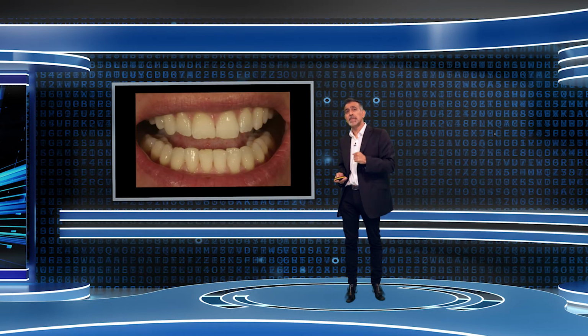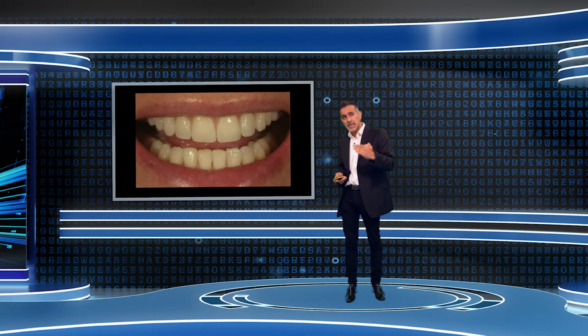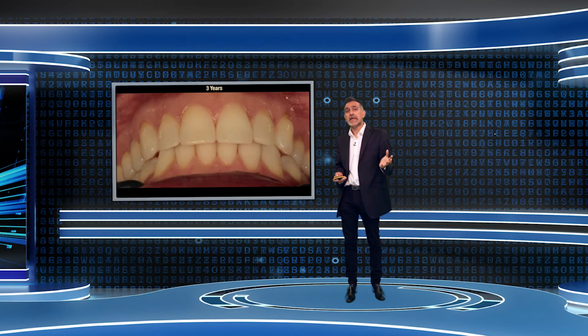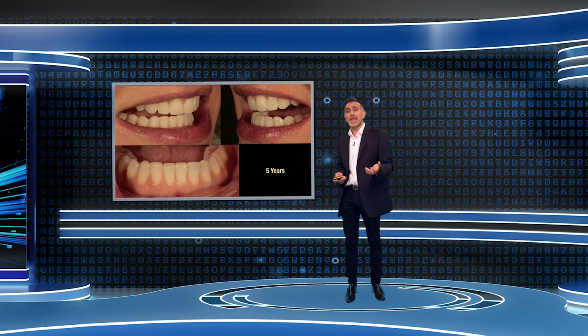And you'll see this case start. Here's our start position. Here is our end position initially. And the next picture you're going to see is actually at 3 years. The lower edge bonding was done at 6 months, and none of this composite has broken off at this point. Here's the same patient from the chin up view. Again, no failures at all. Obviously the patient's using a retainer as well. And here's the patient now at 5 years, a little bit of rubbing on the lower teeth.